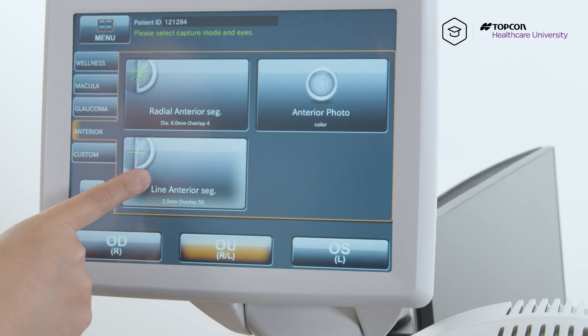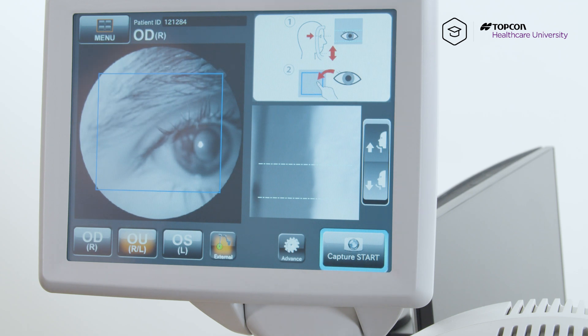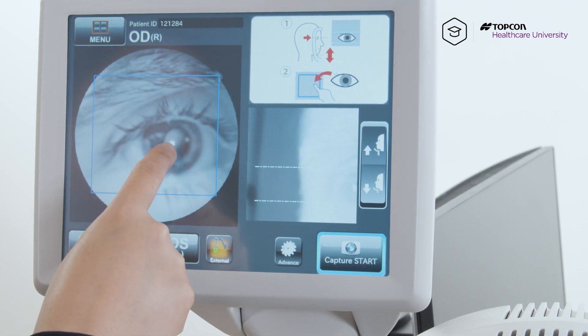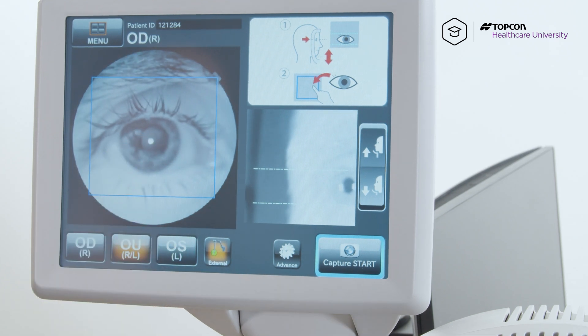We're going to hit line anterior segment. To start off, we're going to center the pupil by tapping on the pupil in the big blue box, and let the patient know to look straight ahead. They're not going to see a target, so just fixate straight ahead and you're going to manually move the camera to image their angles.